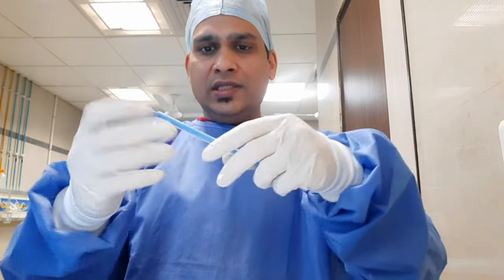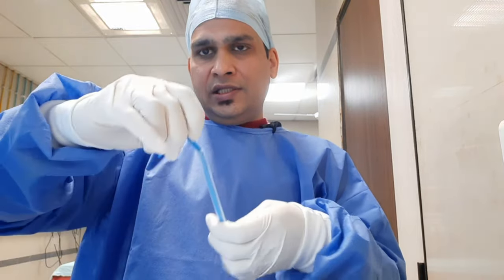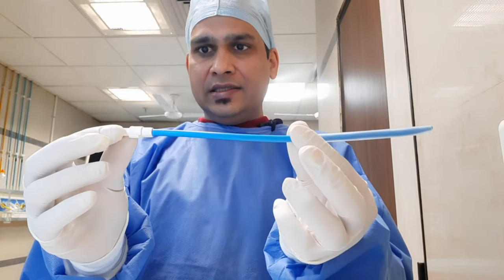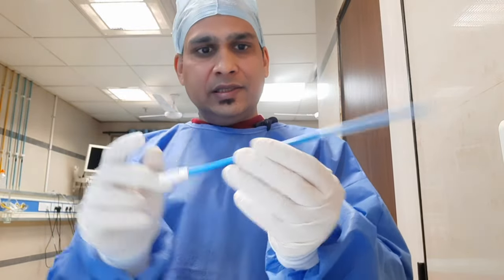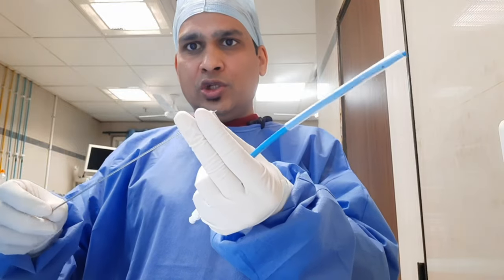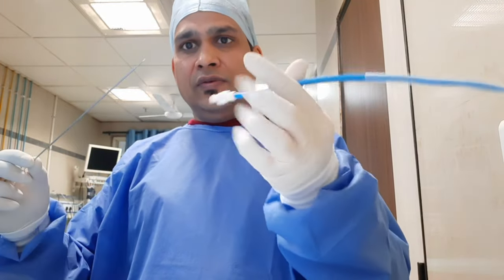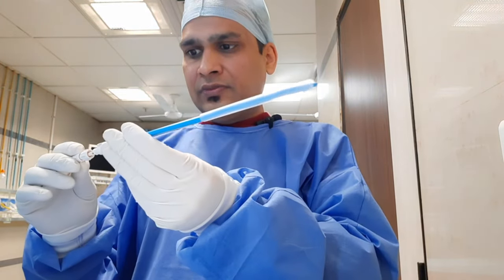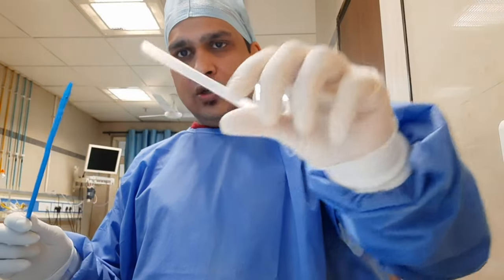This is the pigtail catheter — it is a hollow tube which helps in straightening the tube. This is the head by which the ICD bag connects, this is the hollow tube, and this is the tip. This is the trocar, which is also covered by a hollow tube so it will not injure the physician. We will insert it inside this tube and then remove the hollow tube.